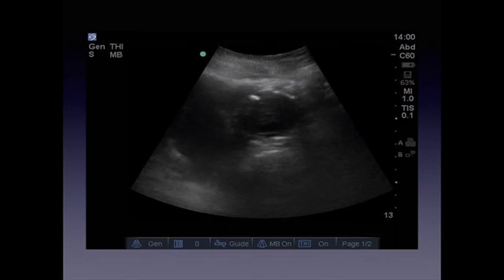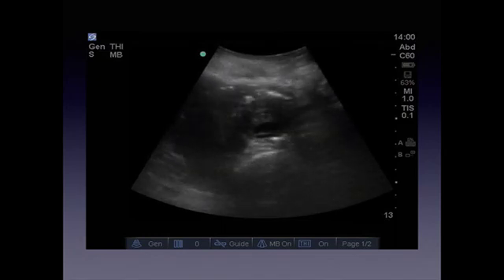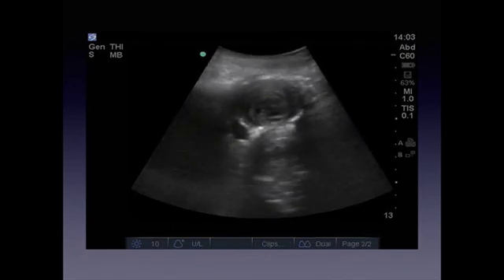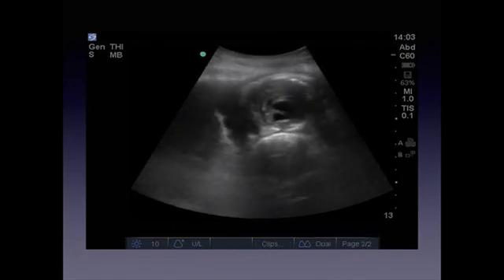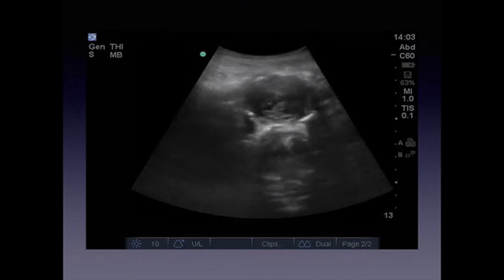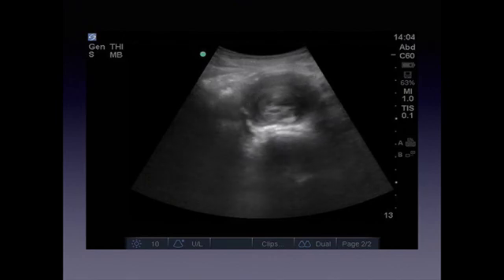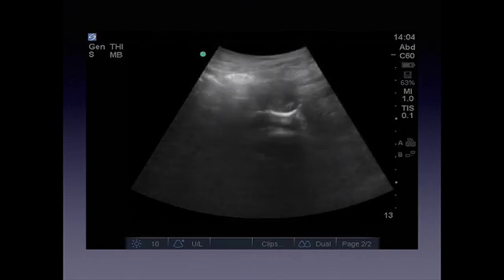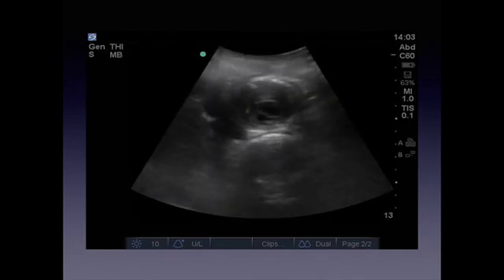Another view of the same. You can see those calcifications at the top, that big thrombus. Scanning through. So this is an intimal flap. So this patient not only has what? We have two things.